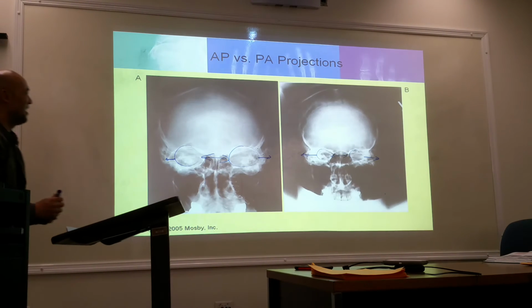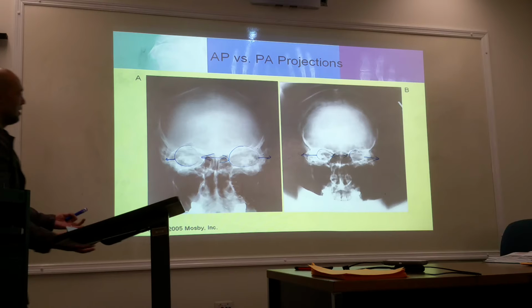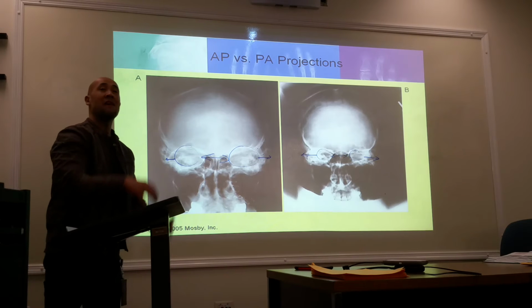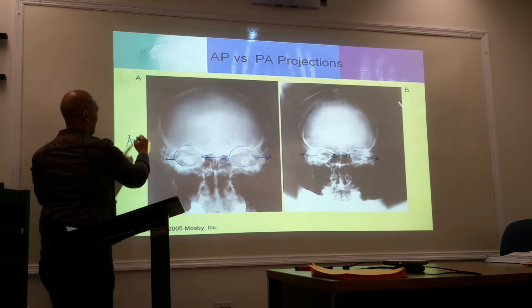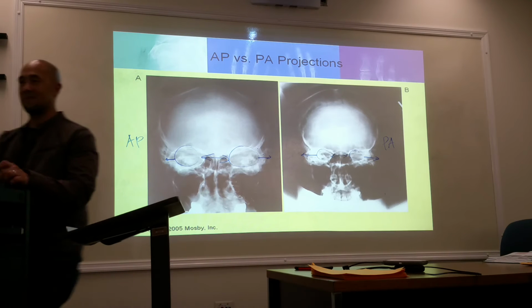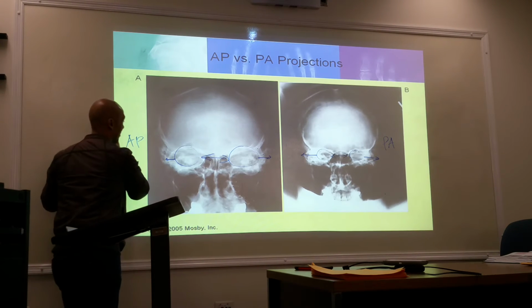Okay? All right. So what did we determine? Which is AP versus PA? This is AP. If it's AP, they're okay. So this is AP, yes. This is AP, this is PA. Okay, we got it?